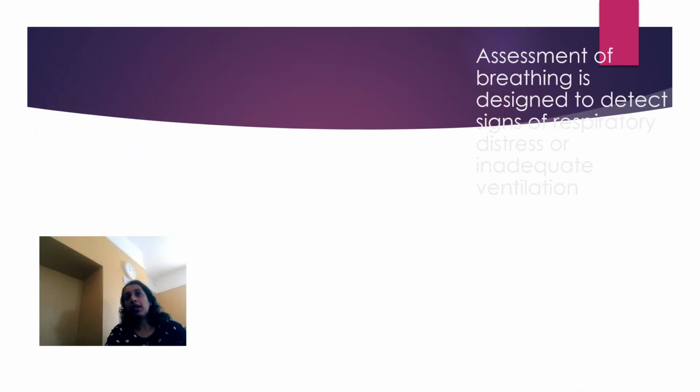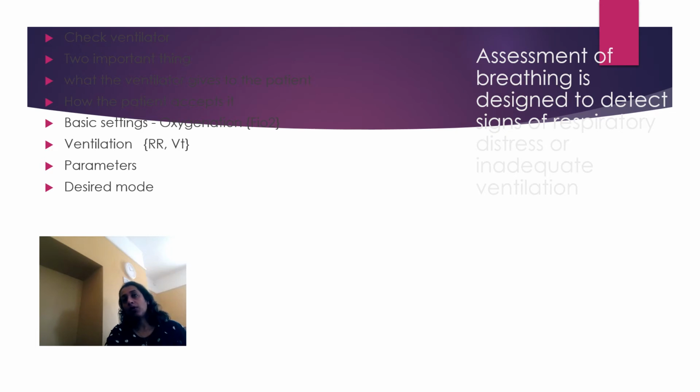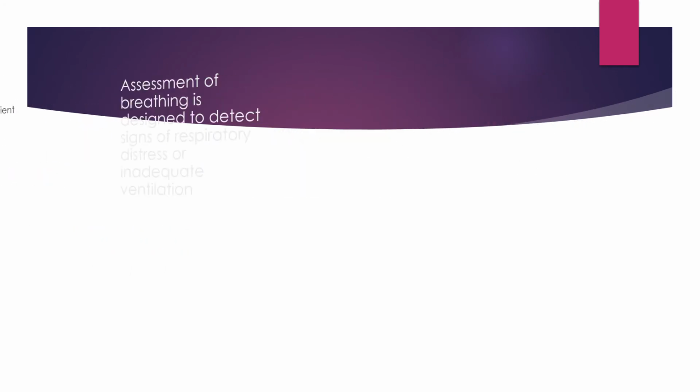Moving to the next, the assessment of breathing is designed to detect signs of respiratory distress or inadequate ventilation. So you will check the ventilator parameters, what the ventilator is giving, whether the patient is accepting it, that means the compliance, basic settings, all the parameters and the desired modes. That comes in the breathing along with the respiration in the respiratory system.